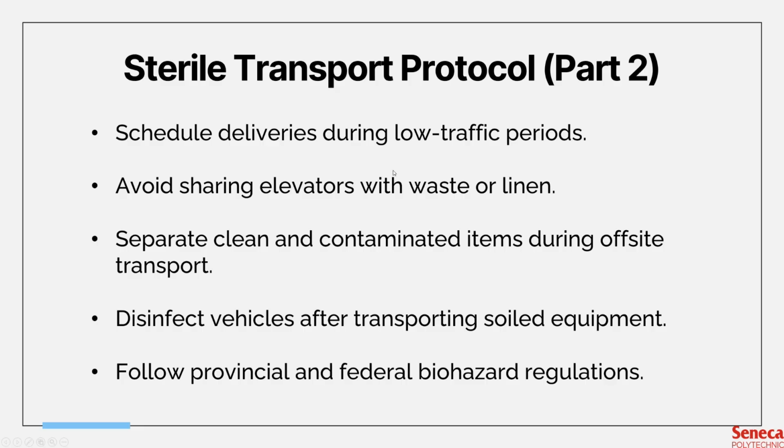Now we're looking at sterile transport protocol part two. Whenever possible, schedule sterile deliveries during low traffic hours to reduce exposure risk. High traffic hours would be 9 a.m. to 5 p.m., for example. When the afternoon shift comes in, that's when they actually start building scheduled case carts for the next day. It takes maybe 30 minutes to build the case carts.